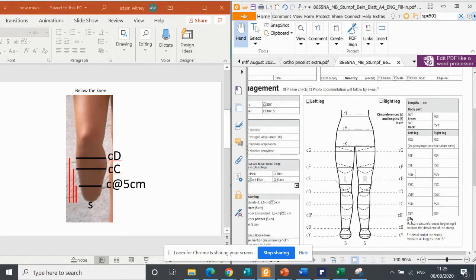Don't worry that it says Y down here. If we're doing a very short stump — as we'll see in a minute above the knee — and the first measurement is F, it's going to be the length from the stump end to F. Let's have a quick look at that now.